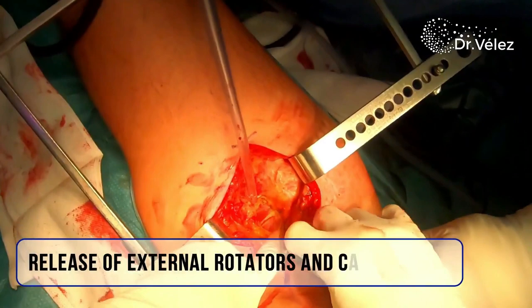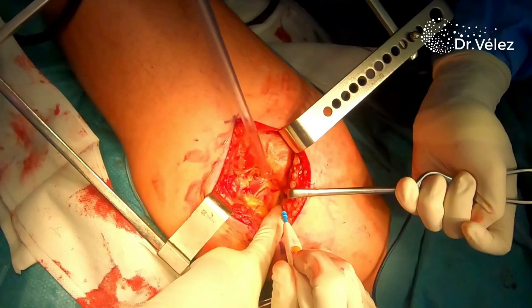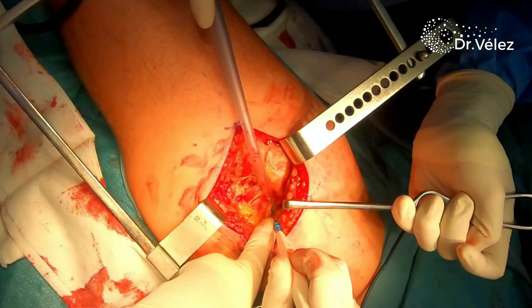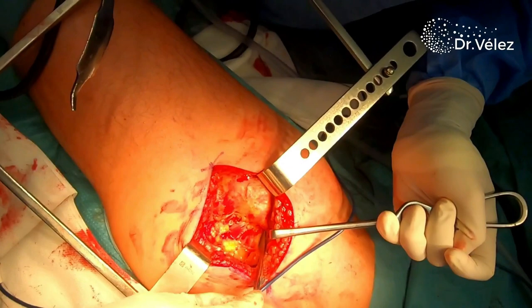After placing the Charnley retractor, we carefully push back the remaining trochanteric bursa with a gauze, exposing the external rotators. We elevate forward the gluteus medius with a retractor, exposing the piriformis tendon, and then with an electrocautery, we separate it from the gluteus minimus.